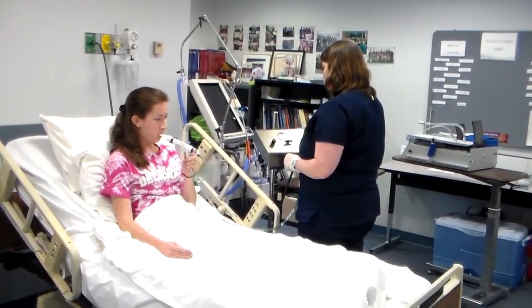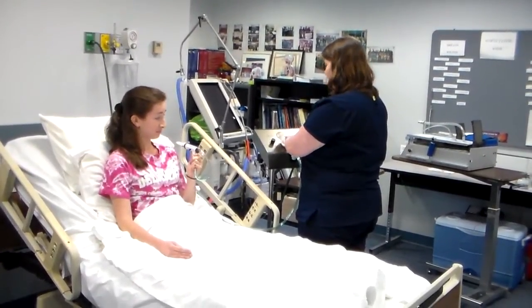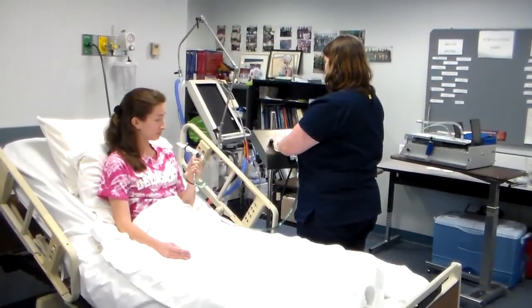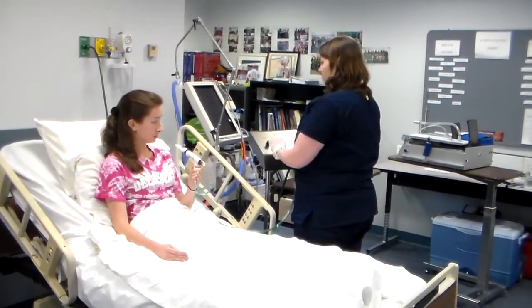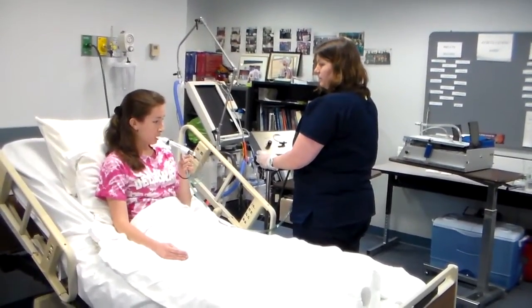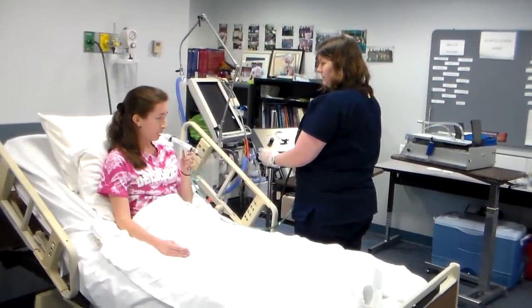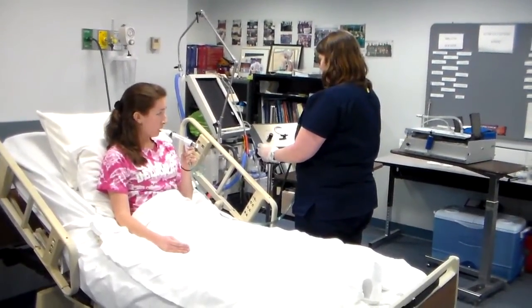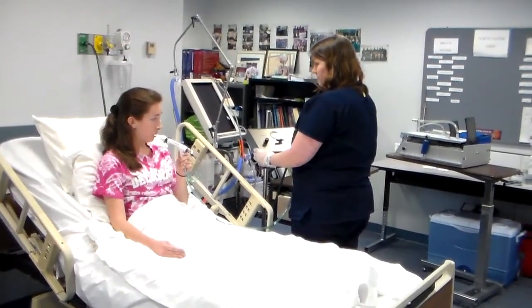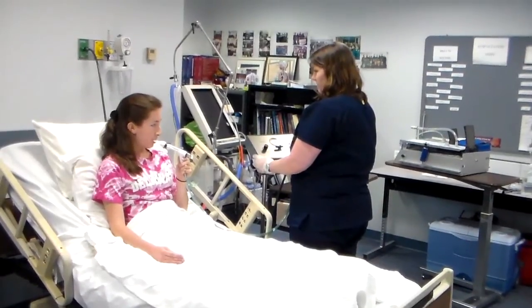After finishing CPEP mode, inform the patient that you will be switching to the CHFO mode. Explain that this mode will deliver pulses of gas, making a noise similar to a choo-choo train. Instruct the patient to continue breathing normally with tight lips and cheeks. Then switch to the CHFO. Begin on the lower pulsation setting, switching to the higher setting if the patient can tolerate it.